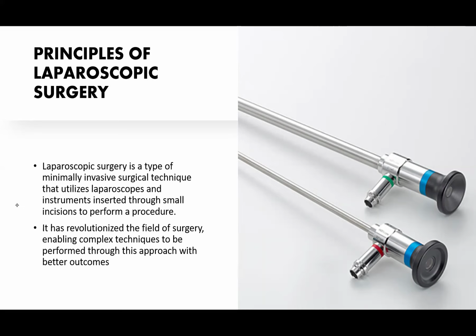To be more precise, laparoscopic surgery is a type of minimal invasive surgical technique that utilizes a laparoscope, as you can see here, these telescopes, and instruments inserted through small incisions to perform procedures. We will see the details of all these during instrumentation. It has revolutionized the field of surgery, enabling complex techniques to be performed through this approach with better outcomes.